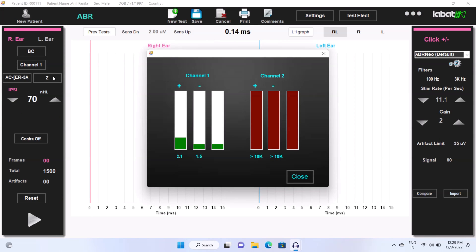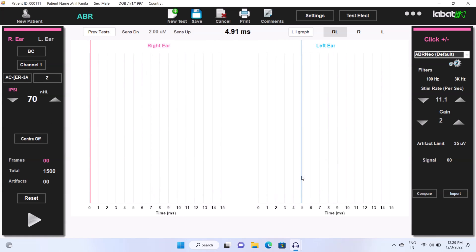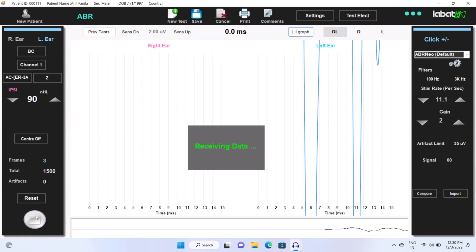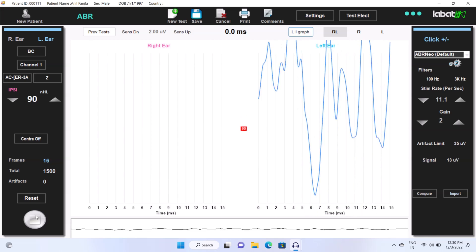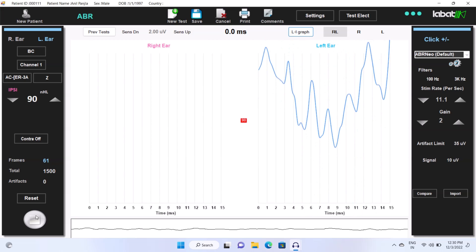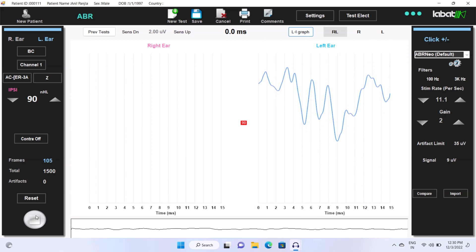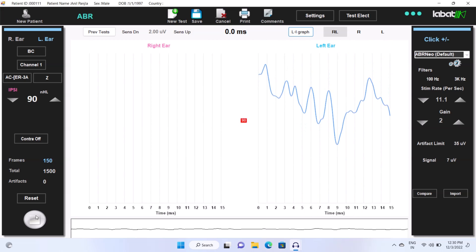Check the impedance. Make sure impedance is low. Click on close. Select the channel and test ear. Now we are doing test on 90 dB intensity.